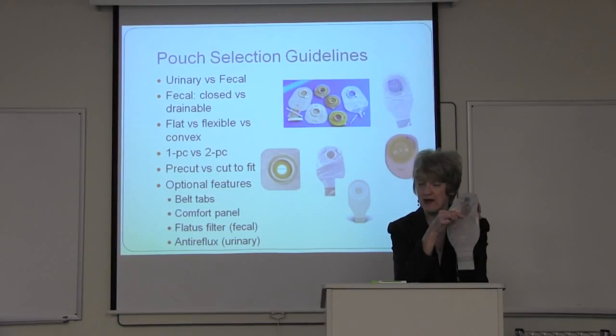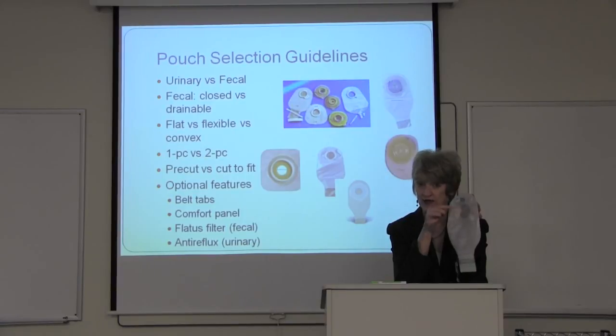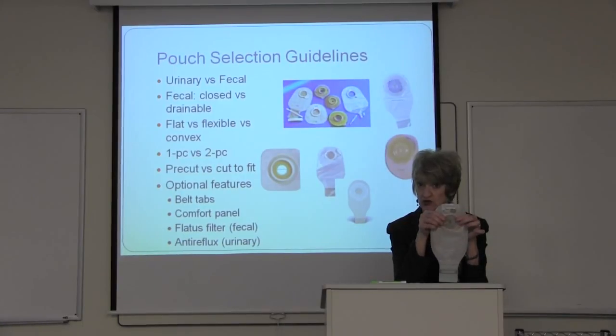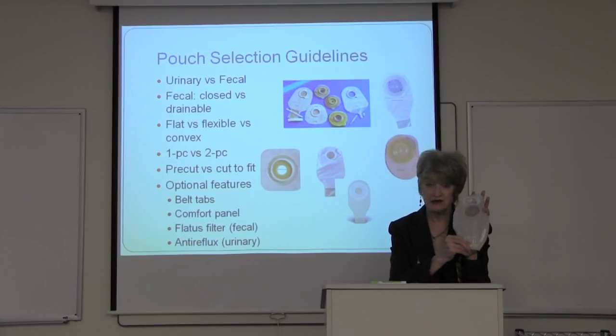The companies that make ostomy pouches actually studied the size of the fecal odor molecule, and then they worked with plastics manufacturers to create a plastic film where the pore sizes are smaller than the odor molecule. So the odor molecule cannot get out of the pouch, and you can be very reassuring to your patients. You can tell them with great confidence, if your pouch is stuck down, the end is closed, the spout is clean, you will have no odor.